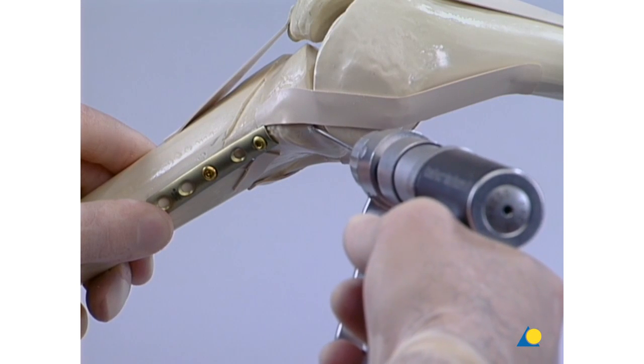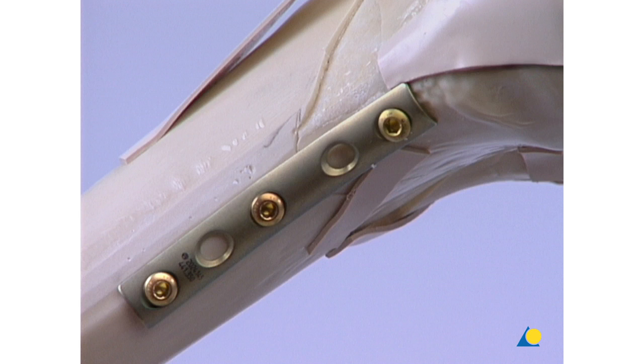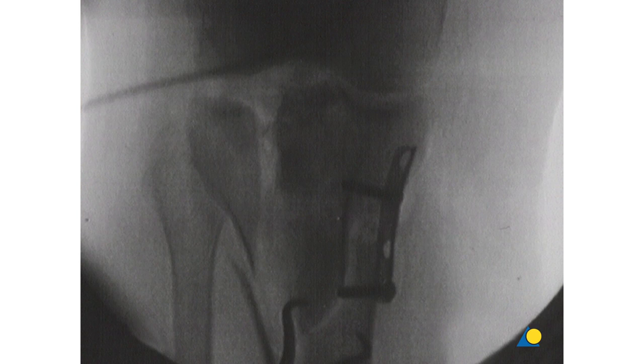The K-wire must now be removed. The third cortex screw is inserted through the most distal plate hole. At this point, an intraoperative x-ray is advisable, as in this clinical example.